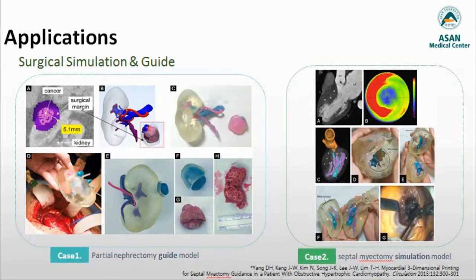In surgical planning and operating processes for personalized treatment, 3D printed patient-specific phantoms and surgical guides have recently been used more and more, often for better understanding of complex procedures and to simplify the operating procedure in the operating room.